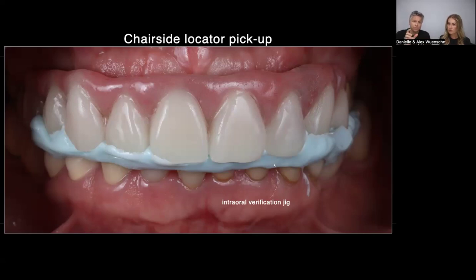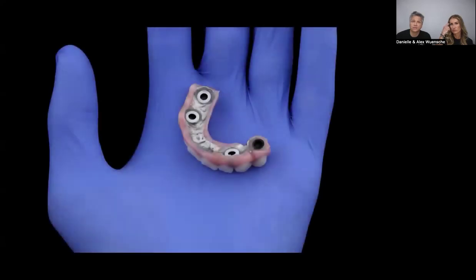You establish occlusion and the bite before you even go into any procedure, picking up any attachments. You do that little bite, right? All these things help you down the road to actually be done quicker at the end. That's the point. And the case looks better and the patient is more happy actually.